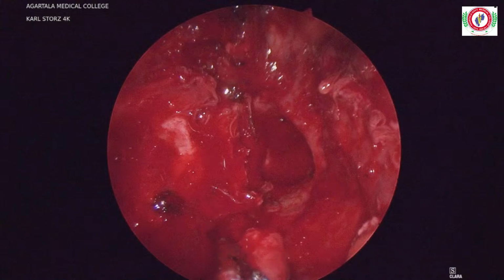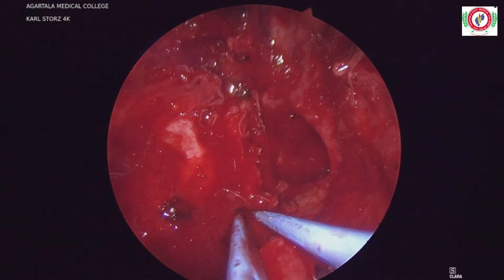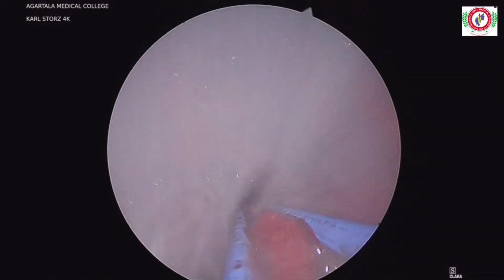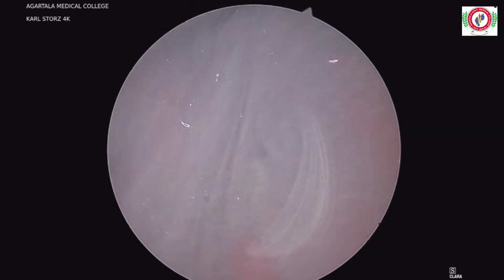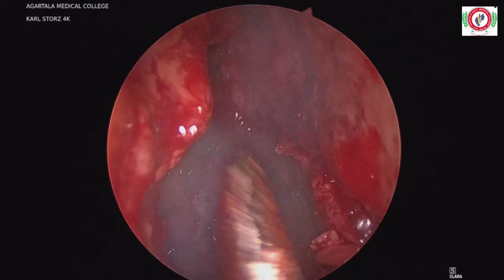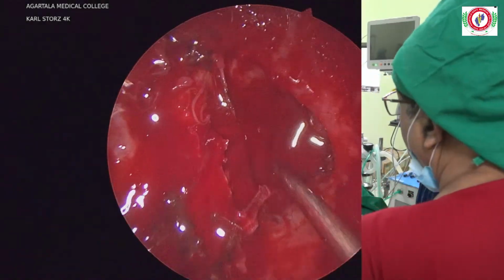Give me bipolar. I need to bipolarize this also. Bipolar. Press. Press, yeah. Okay, that's all. Suction.